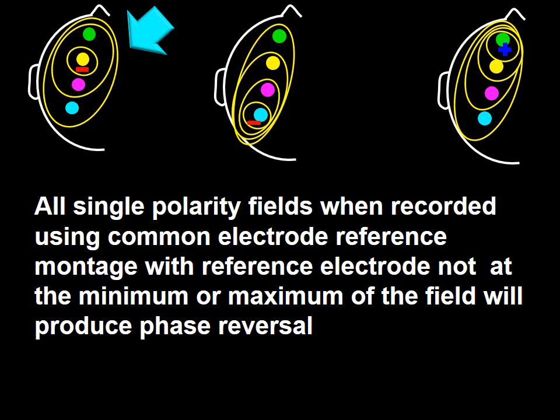This situation, that is the presence of a contaminated reference, can occur with a field with its maximal amplitude in the middle flanked by lower amplitudes, can occur in the presence of a field with its maximal amplitude in the posterior polar region, or a field with its maximal amplitude in the anterior polar region.